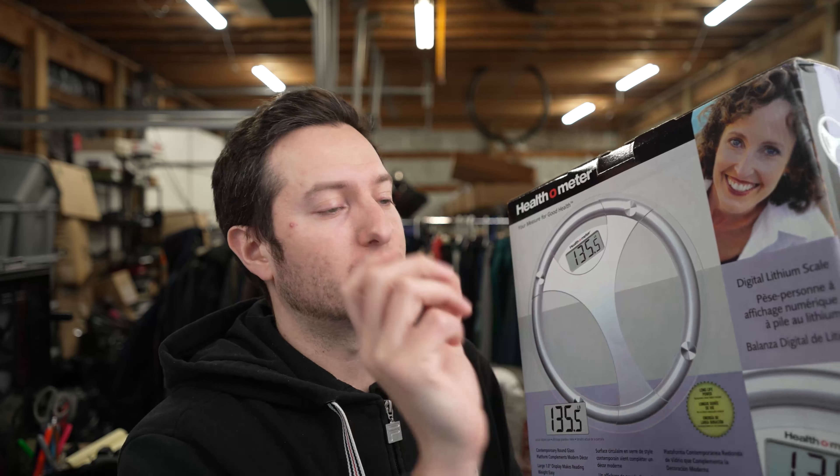It has a nice glass exterior — this is the circular model, though some people go with the square one. I think the circular one looks cooler. It has a very minimalistic look. There's also a large one-inch display, so you'll be able to clearly read the numbers rather than squinting when you weigh yourself. It's a nice bold numerical readout.